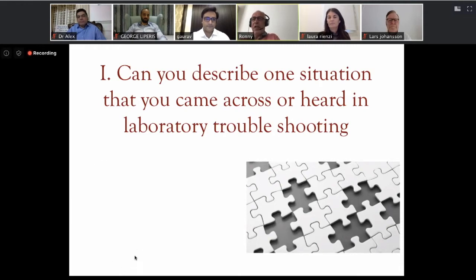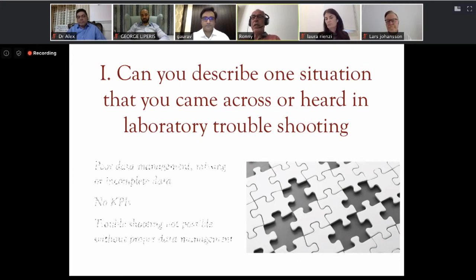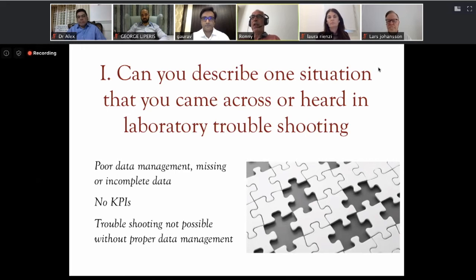Laura, for this introduction. Well, I'm not going to mention one specific point, but rather a general problem when doing troubleshooting, that is poor data management. If we as consultants or auditors or troubleshooters come to a place and start examining, you need first to be able to define whether there is a problem or not, and that you do based on proper data.